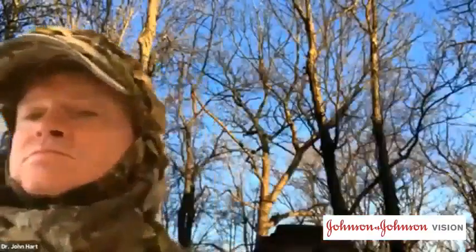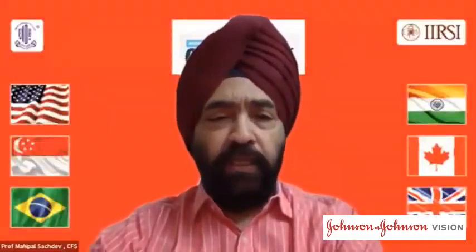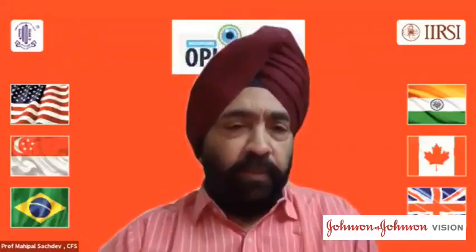Thank you. So Mahipal, can you continue, your team members next? Yeah, Kevin, it's all over to you with your magic hand, your magic fingers and the devices. How do you handle subluxated cataracts? Over to Kevin. All right.